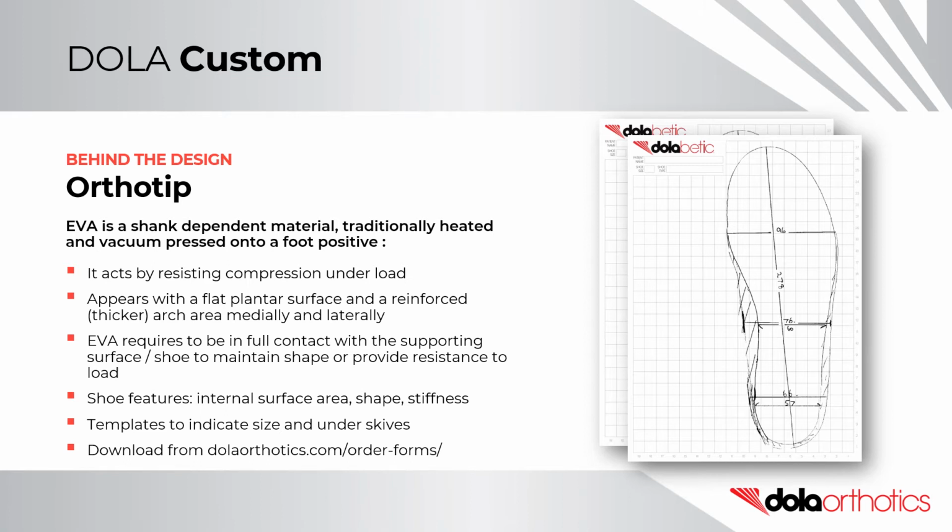EVA requires to be in full contact with the supporting surface of the shoe to maintain its shape or provide resistance to load, otherwise known as being shank dependent. Therefore, the attributes of the shoe, the internal surface area, the shape, and the stiffness will impact on the suitability for an EVA orthotic.